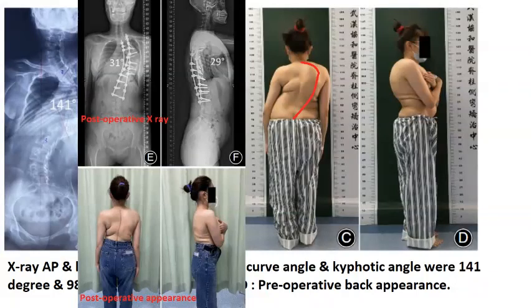This next figure shows the postoperative X-ray. It shows there's a correction from the AP view to 31 degrees and the lateral view to 29 degrees. And this is the postoperative appearance.